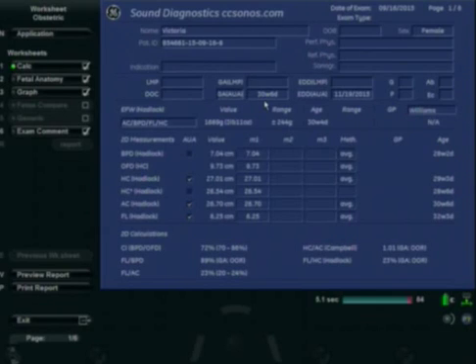See, the way this works is 6.5 and 7 pounds is actually average. So if you have a 6.5 or 7 pound baby at 40 weeks, the ultrasound would say 40 weeks. If you have a 10 pound baby at 40 weeks, it's going to say like 42 or 43. That's where these numbers are coming from. Not necessarily that your baby should come earlier. However, in your situation, with your doctor, I'm sure it probably is going to happen that way. But that's where these numbers come from. It comes from the average size of the baby.